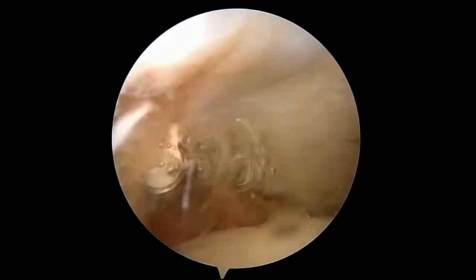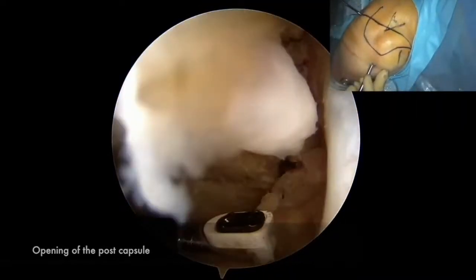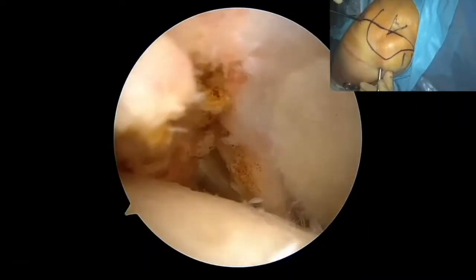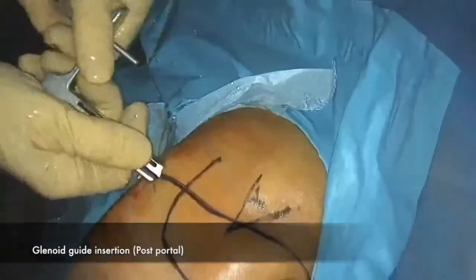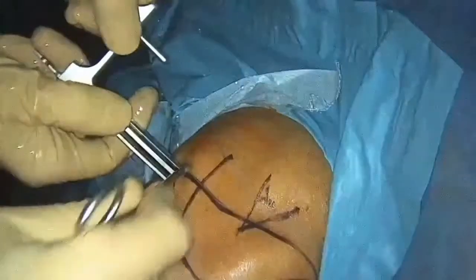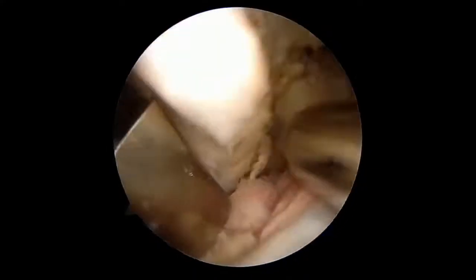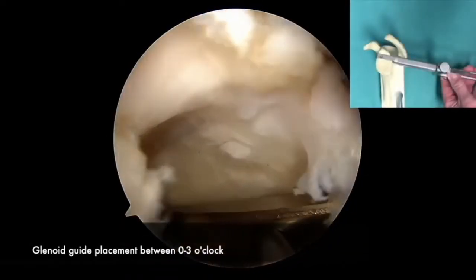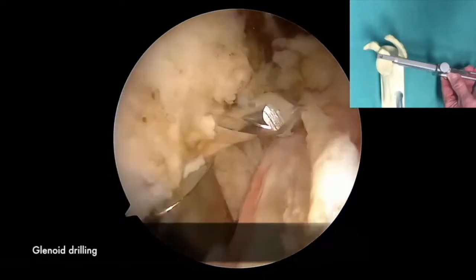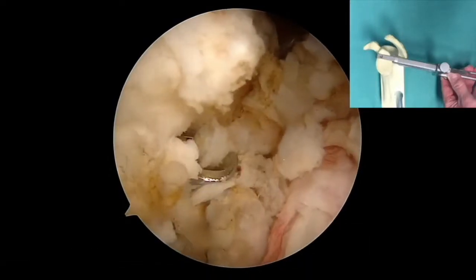The posterior portal and capsule are dilated to allow placement of the glenoid targeting guide. The glenoid targeting guide is placed across the anterior face of the glenoid, hooking around the glenoid neck between 12 and 2 o'clock. A 3.2 mm drill bit is then placed through the targeting guide and subsequently exchanged for a cannula. The targeting guide is then removed from the shoulder.